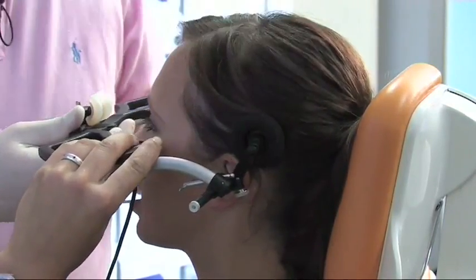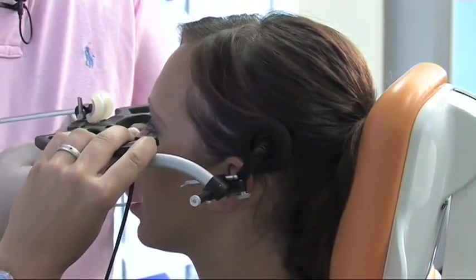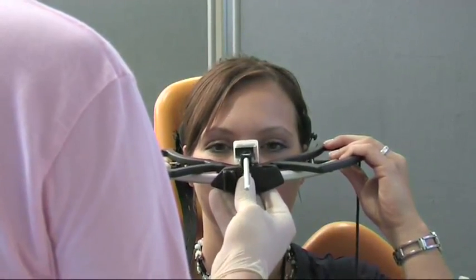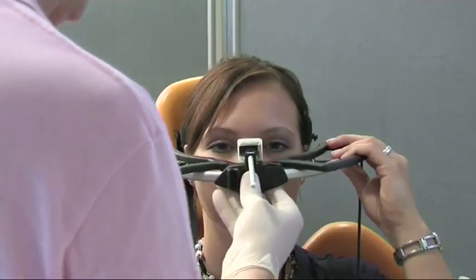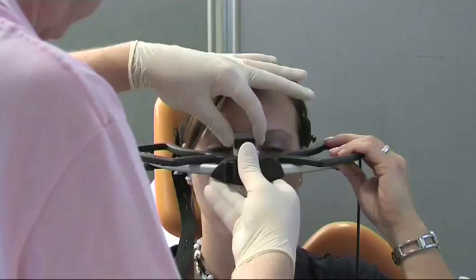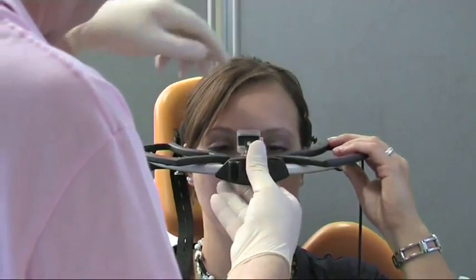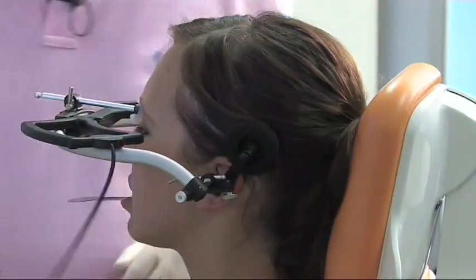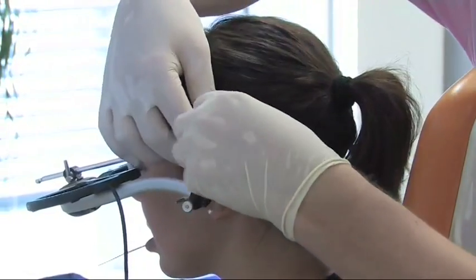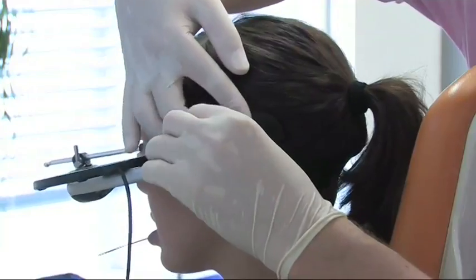Very good. If it's pressing or pinching, please let me know. Now, everything okay? Good. We will fix this here so that nothing moves during the registration. It's not too tight, is it? Okay, good.